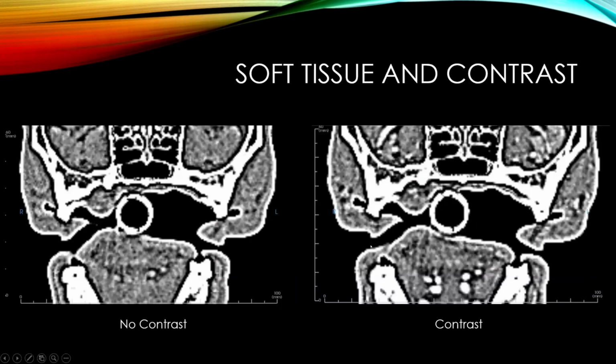If we zoom in on it, between the pre-contrast and the post-contrast, maybe there's a vessel running through it that lit up a little bit, but it doesn't seem to enhance too much, and it doesn't seem to show any bigger margins or anything like that. So again, what we can say about it is it doesn't seem to contrast enhance on a soft tissue cone beam. Whether it would be more information from a conventional CT, that would be a good question, but we don't have one.